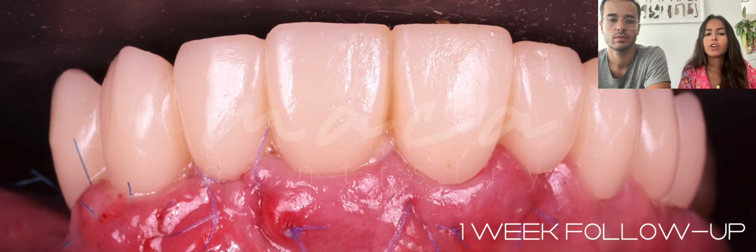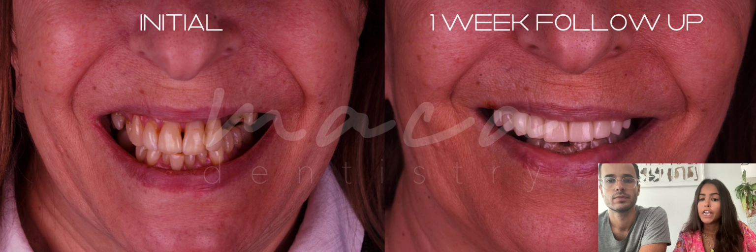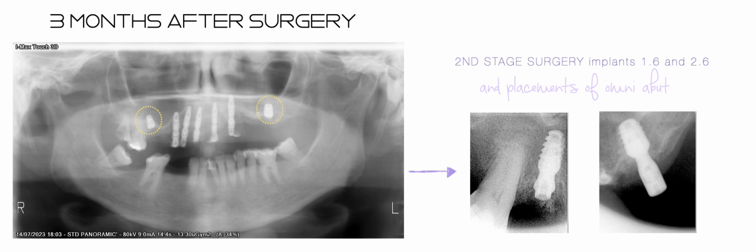Here you can see the intraoral picture 1 week after the surgery, and here the extraoral picture also 1 week after the surgery, in which we can already see an improvement in the aesthetics of her smile. This is a 2-week follow-up, everything is healing well. And then, as Katrina was telling, 3 months after the surgery, we did the second stage surgery of the implants that had been submerged because of the lack of enough primary stability to load.